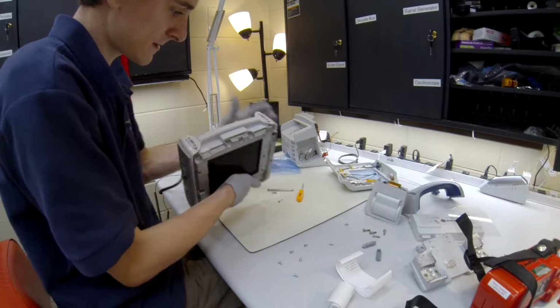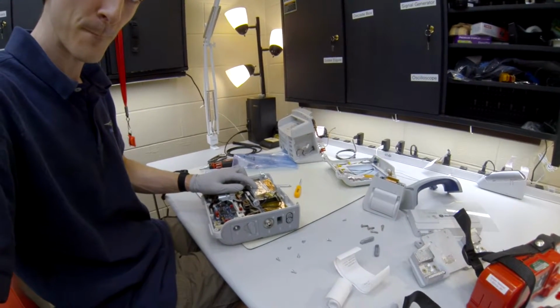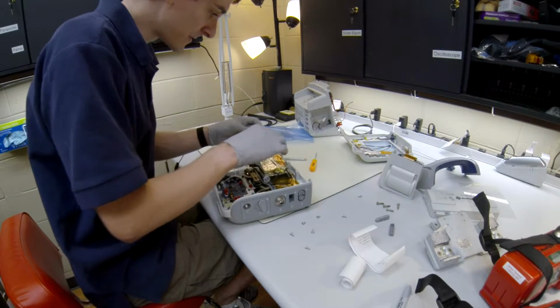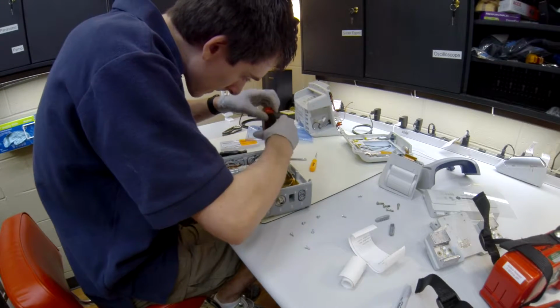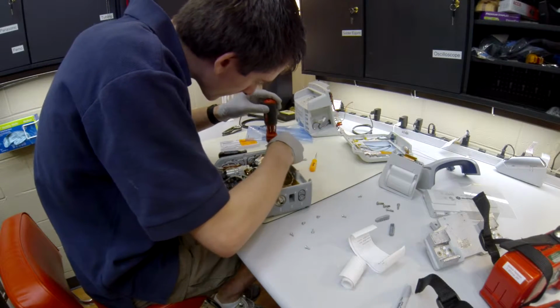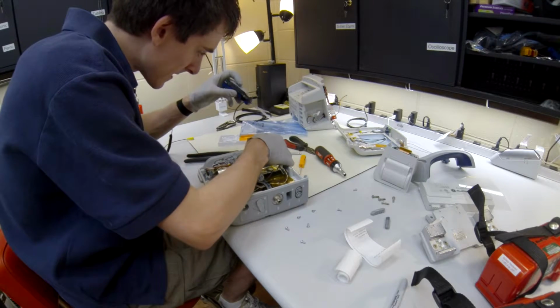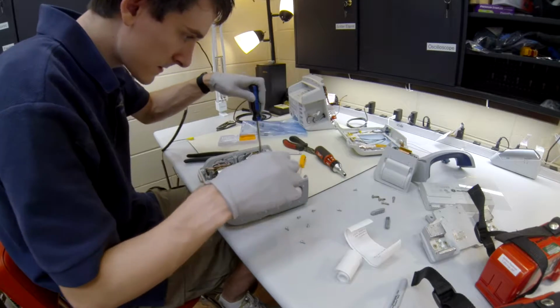I'm going to put it down like that, flip it around, and like I said earlier, this piece right here, let's pull it down just a little bit. Come on. This piece right here is your end-tidal CO2, and this is the grounding shield right here. So we're going to take our X, put it back in. Oh, magnetic, go figure. Okay, so now we're going to assemble this piece again, this grounding strap. Okay, she's good to go.